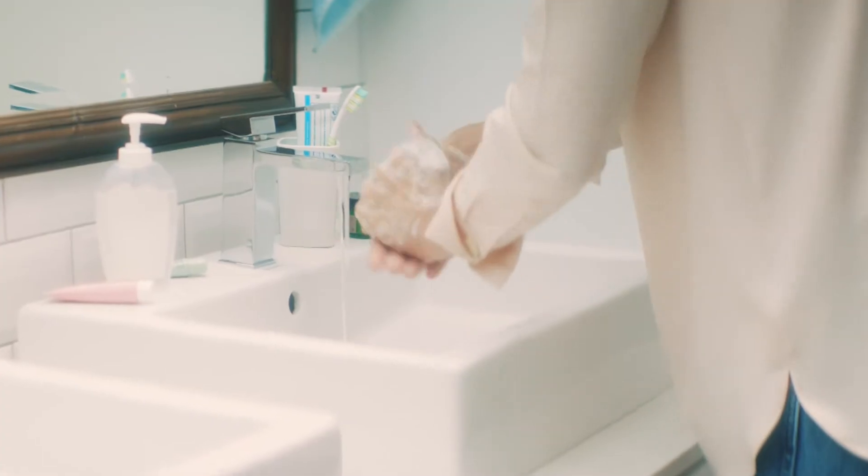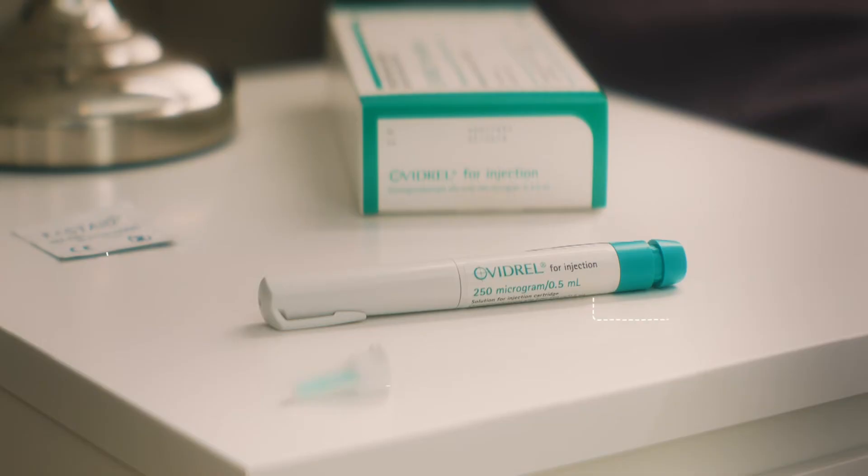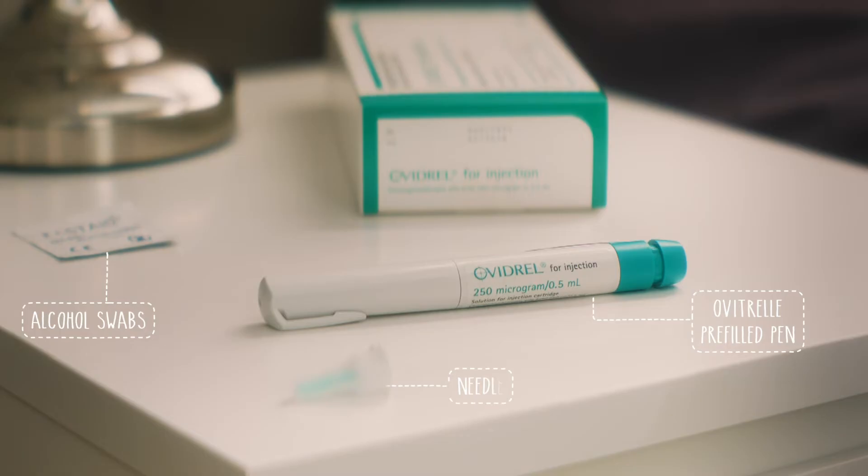Before you get started, make sure you've washed your hands properly with soap and water. You'll also need to make sure you have all the things you need for your injection: the Ovidrel pre-filled pen, an alcohol swab, and a needle.